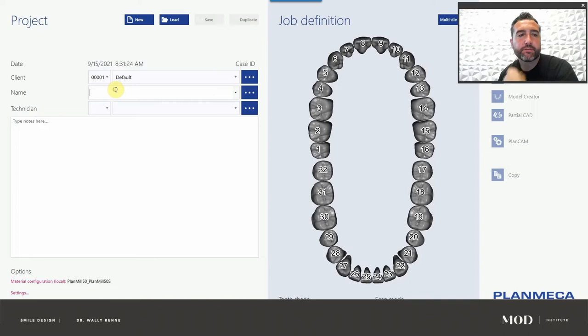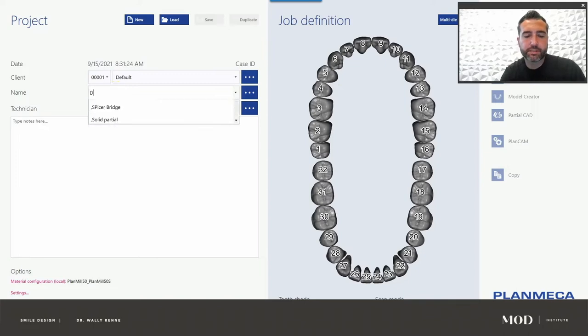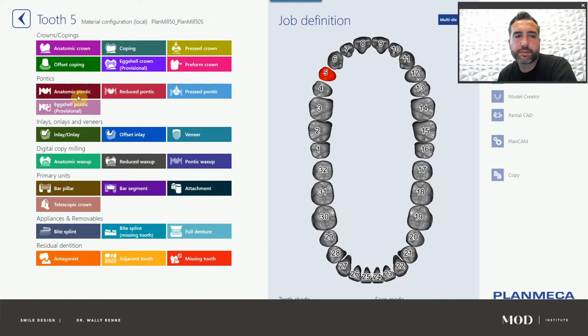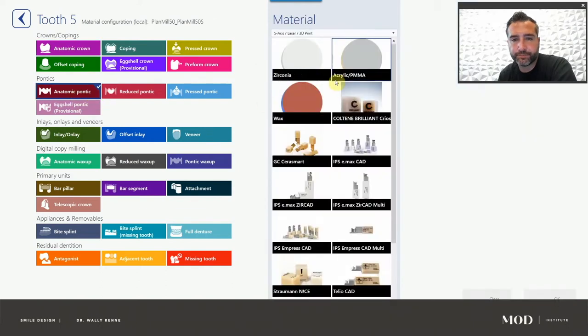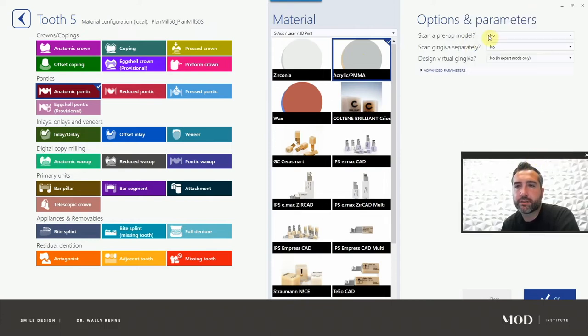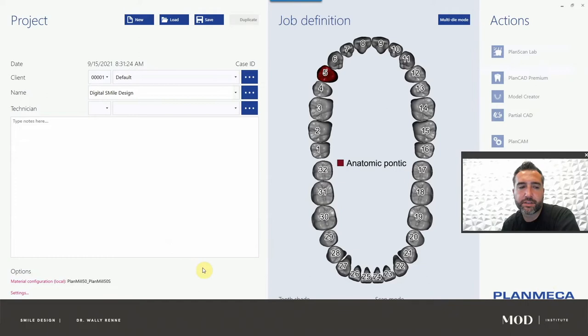Pick a client — let's just call this digital smile design. Go ahead and double-click tooth number five. I'm going to call this anatomic-pontic. We'll probably 3D print this. Let me pick acrylic PMMA. We're not going to design gingiva or anything like that, so no on those options.